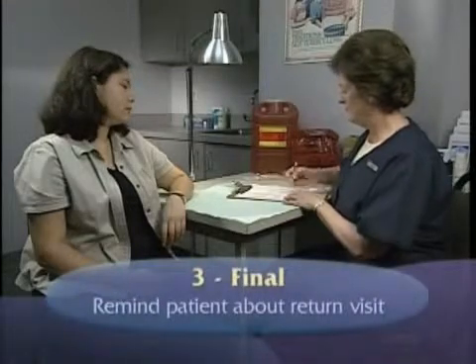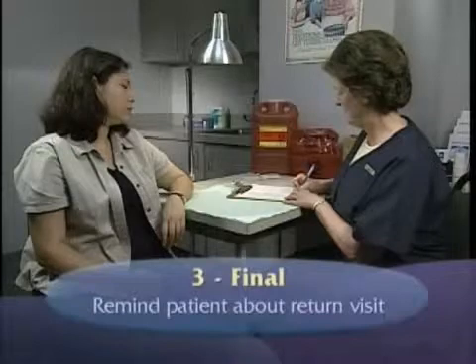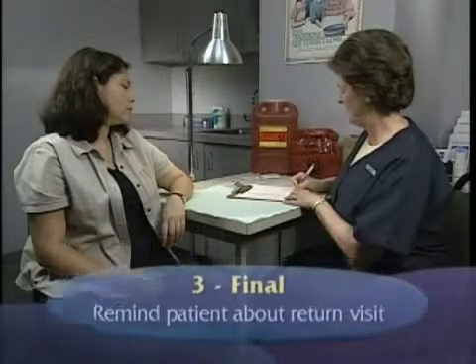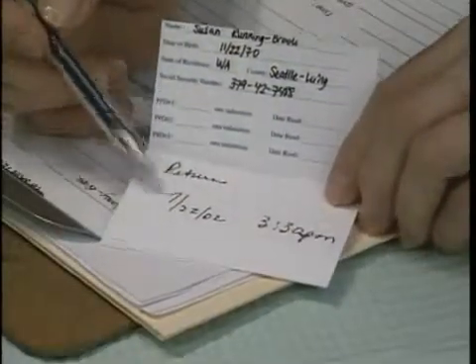Since it's important for the patient to return within 48 to 72 hours to have the test result read, always remind the patient to return. Giving the patient a card with information on care of the site and the date for the return appointment may help serve as a reminder.